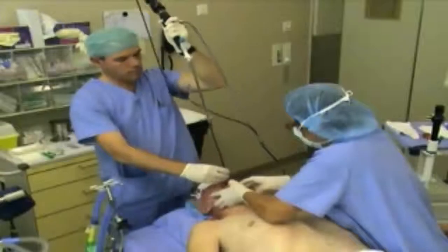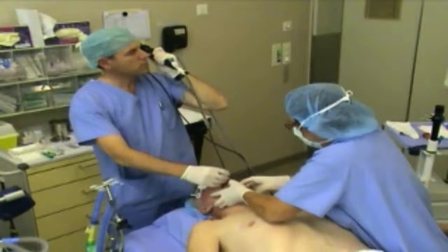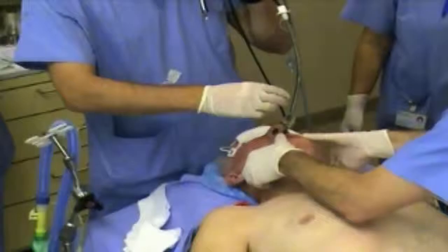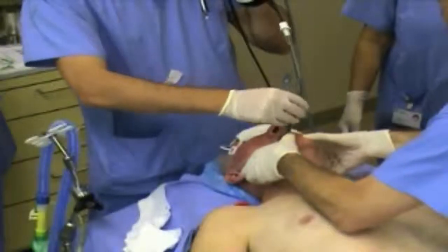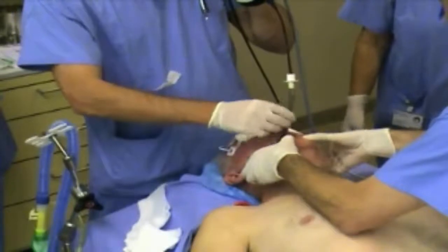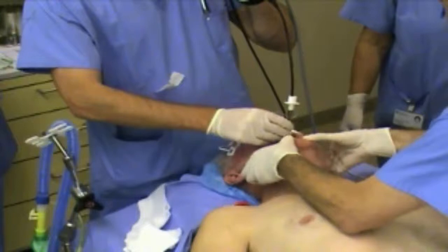Insert the fibroscope at the midline and follow the posterior wall of the oral airway. The end of the epiglottis can be easily recognized as you proceed. Advance the fiberscope through the glottis just above the carina, as demonstrated previously. When the insertion of the fiberscope has been completed, remove the slit oral airway and advance the flexible tube using rotating movements while maintaining the chin lift and jaw thrust maneuver.